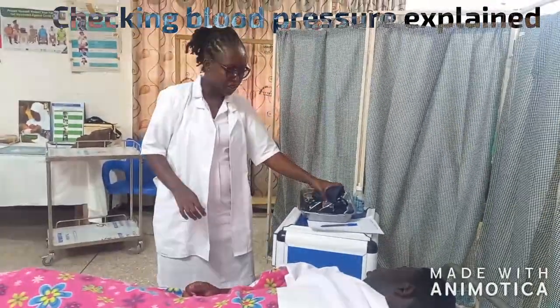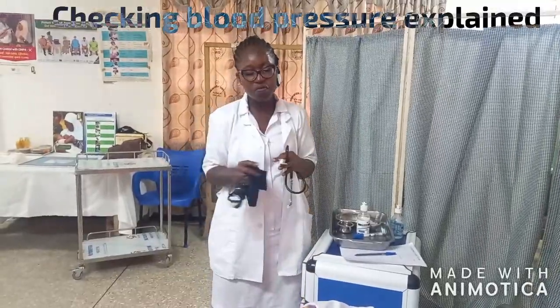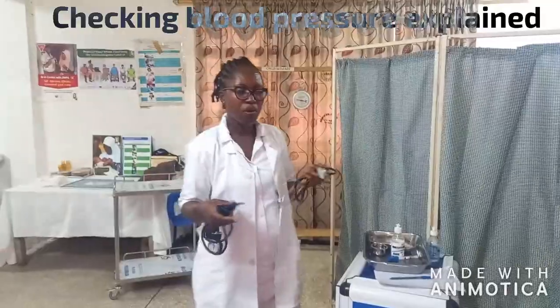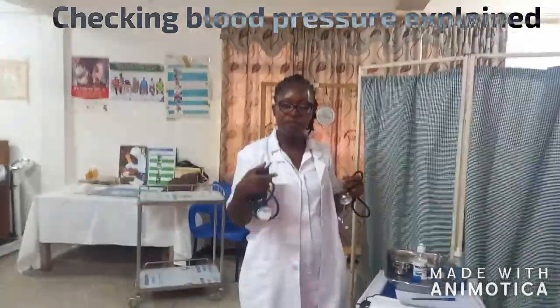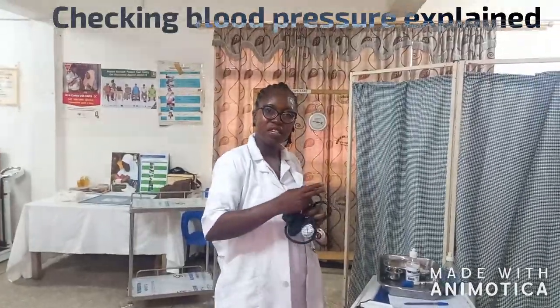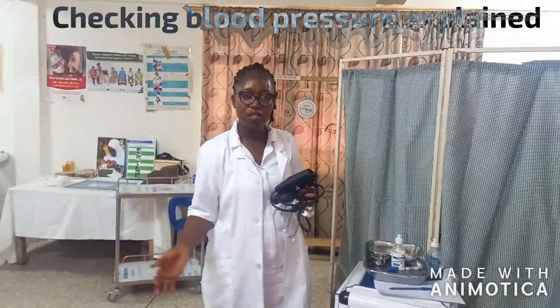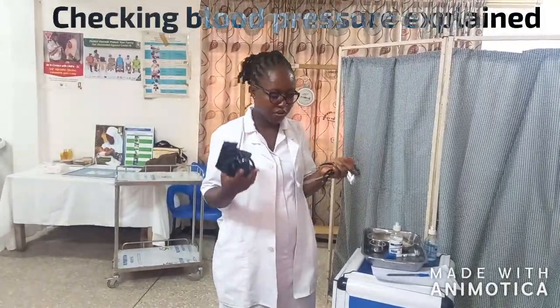When we are taking blood pressure, I'm using it to check the patient's blood pressure. If there's nothing wrong with the patient's arms, it's better to use the left arm because it's closer to the heart and you can get the pressure more accurately. If the bed is attached to the wall and you can't get access to the left arm, or your patient cannot sit down, then allow the patient to use the right arm for checking the blood pressure.